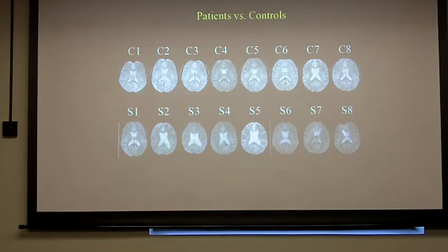Right, so like a VBM analysis, say. So if your warping is perfect, then that destroys your VBM analysis. But it would still be useful for VLSM and for localizing lesions. Exactly, but I assume that in the case of TBI or VBM applied to stroke or anything like that, you're interested in the atrophy. So why are you happy if it goes away in the warp?